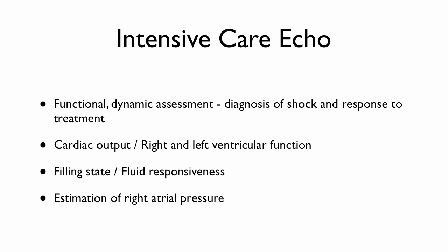Specifically when we use echo in the ICU, it's really a functional and dynamic assessment, and it's most commonly used in the diagnosis of shock and looking to make some assessment of the response to treatment. So we want to know things like the cardiac output and the right and left sided cardiac function, and also an assessment of the preload, the filling state and volume responsiveness, and as part of that an estimation of right atrial pressure.